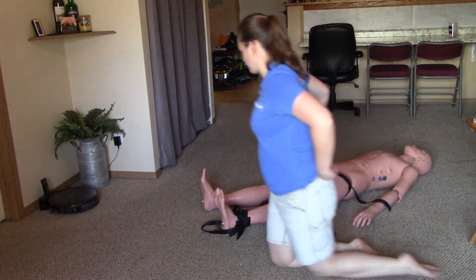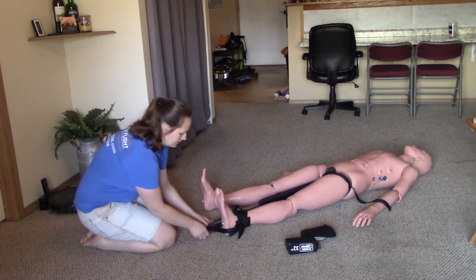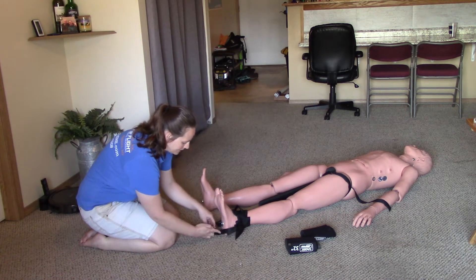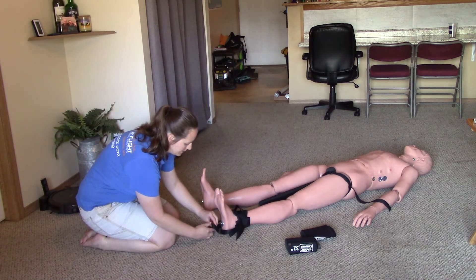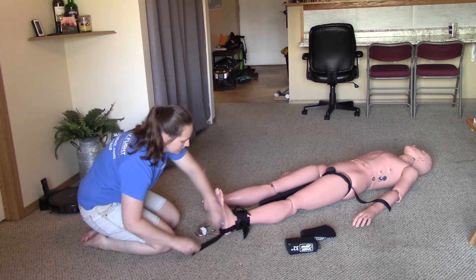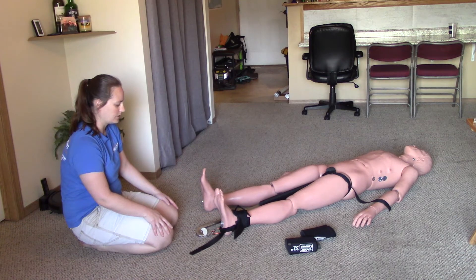I'm now ready to attach the ankle hitch to the carabiner. I'll go ahead and attach that, make sure everything's in good order, and then tighten up the ankle hitch to shorten up the splint. I don't want it right up against the foot, but I don't want too much of a gap either, because it's going to make the splint unnecessarily longer.